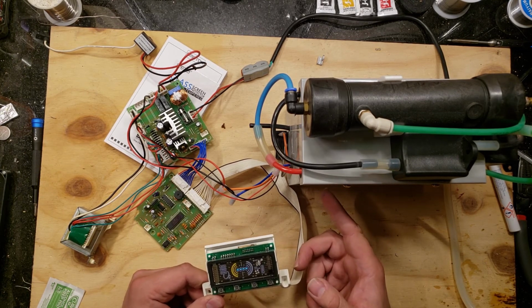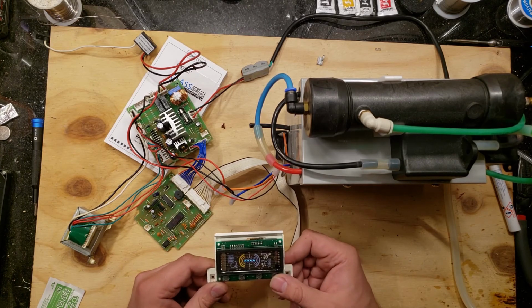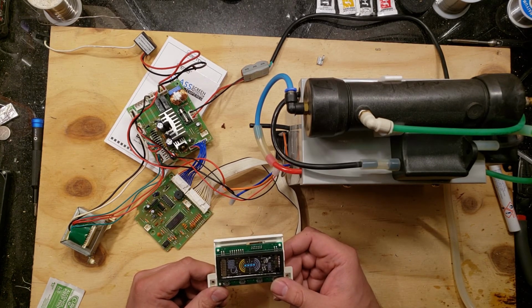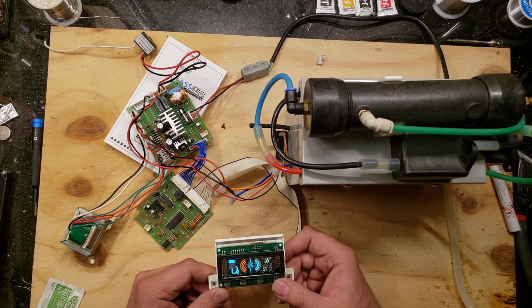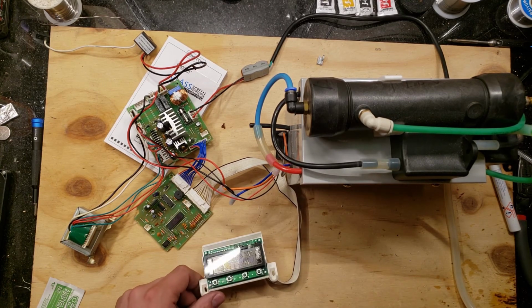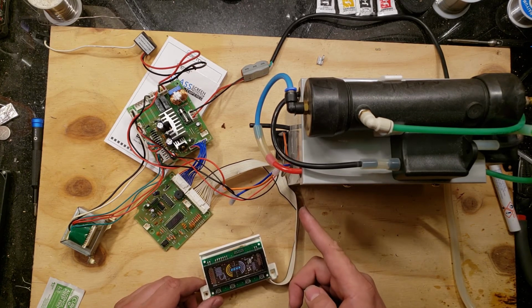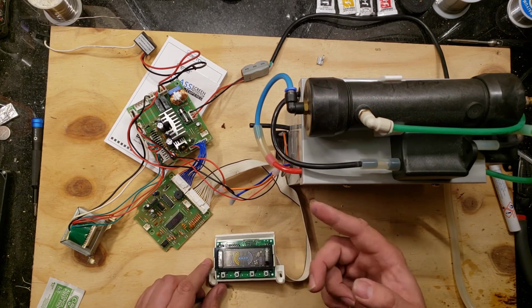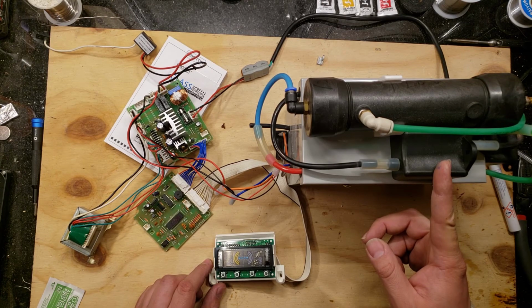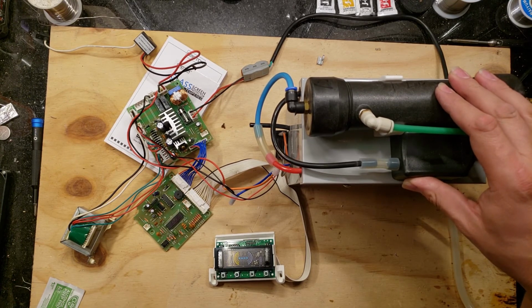Also, this is a kickstart motor, so if you turn it off and then turn it right back on, it does not start. And it seems that the board is making funny noises when that doesn't happen. It's a bit noisy outside right now, so I don't know if you're going to hear that if I try to do it on video. So here I start it. It started up. I turn it off and I turn it back on again. And it sounds like something's about to burn up on the board when I do that. So I'll need to make sure that this times out first and not turn itself on. So I'll need to take care of that in a little circuit. So I'll need a power supply for the fans and a timer circuit that would take a second to time out before restarting the compressor. But yeah, this seems to be a fully functional unit that produces the amount of oxygen that was advertised.